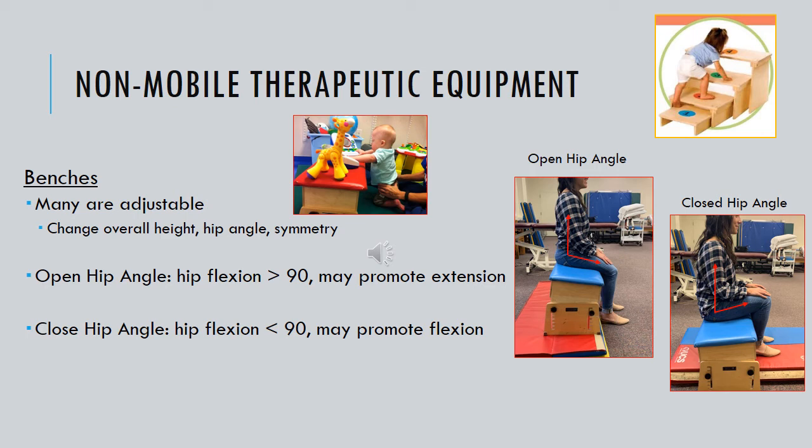In this position, the patient may have more of an anterior pelvic tilt, which might then promote a more upright trunk position or spinal extension. And then the converse of that would be true.